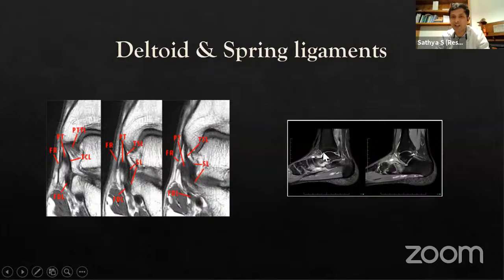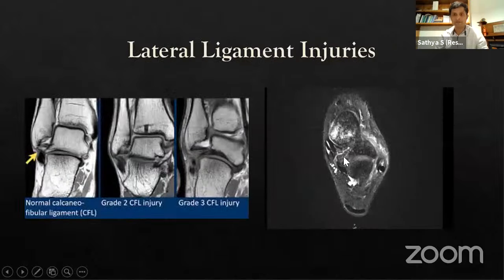The nice white line, we call it, it's like the third day or the second day after Black Moon Day, we are able to see how the moon ring is forming there. So the same way we want to see a ring that is forming on the dome of the talus. So that helps us to understand how these structures are present. I'll show you in the next few films how a talar dome lesion is present also.